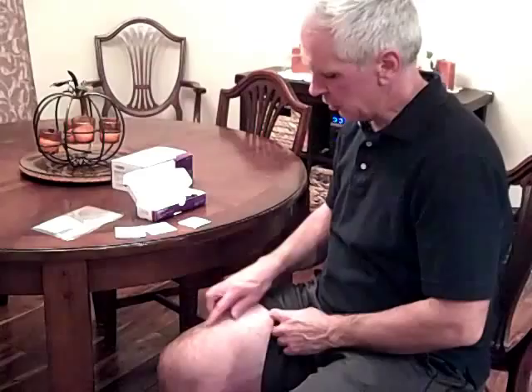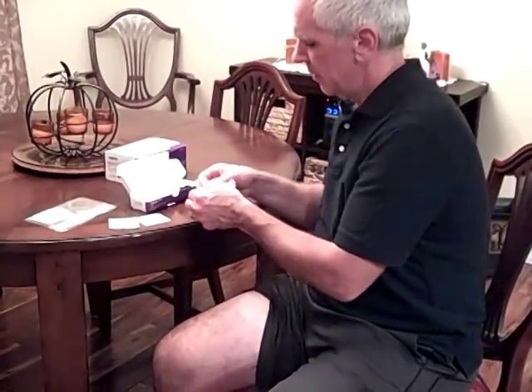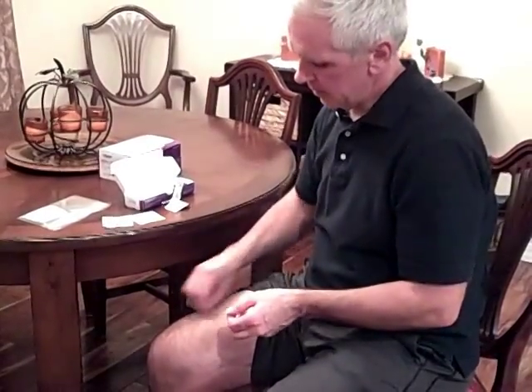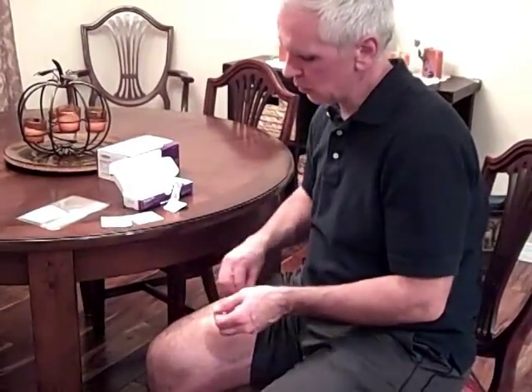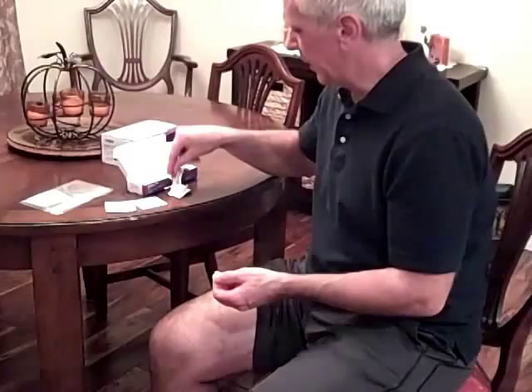Then I'll open up my injection area, which is the top of the thigh here. I'll go ahead and clean it up real good with the alcohol swab. I've got that alcohol on my fingers also to help me just be a little bit cleaner.